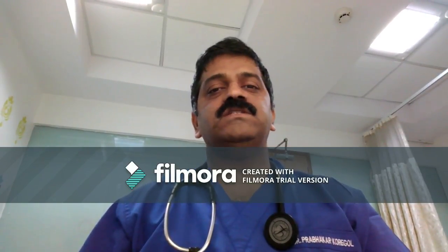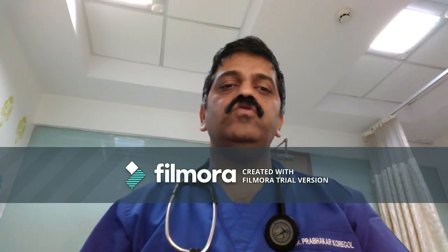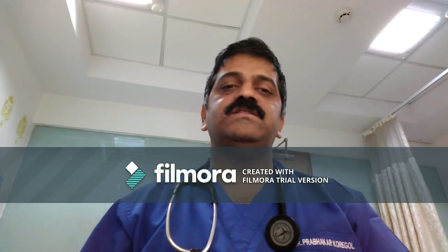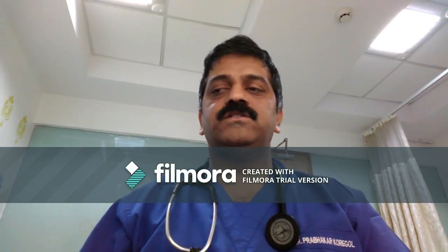So to make a diagnosis of MI, you need to have an ST elevation in at least two contiguous leads, that is 2, 3, aVF, V1 to V6, 1, aVL in their different combinations. At least two leads should have 1 mm of ST elevation in the limb leads or 2 mm of ST elevation in the chest leads.